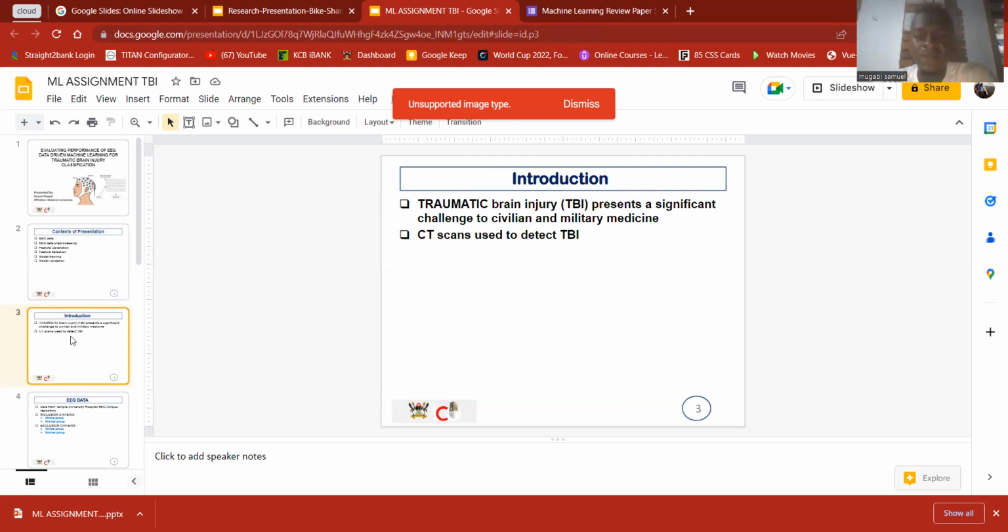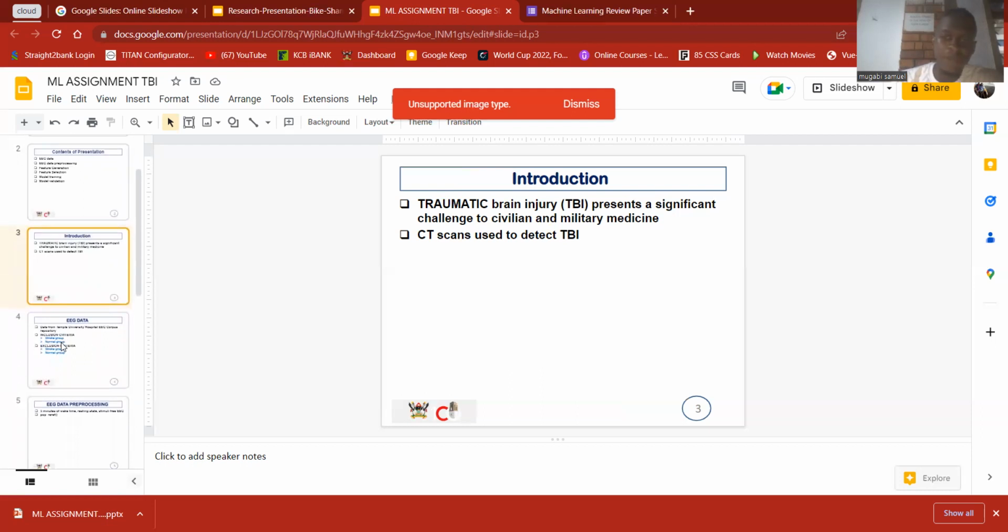Now, these traumatic brain injuries, they've been tried to diagnose using CT scans, but unfortunately, CT scans are not so sensitive like the EEG. They are not able to detect mild traumatic brain injuries. So someone might be diagnosed normal, and yet they have a mild traumatic brain injury using the CT scan, which causes a problem because someone will think they are normal and hence will not go for treatment. Unlike any other disease, the earlier it's detected, the better for the person.